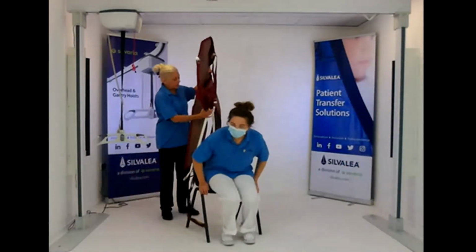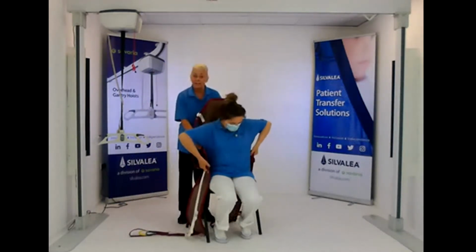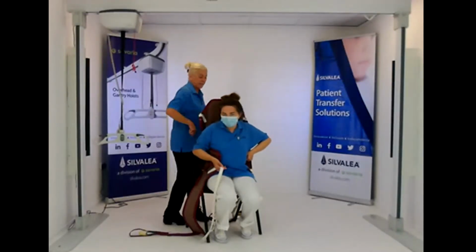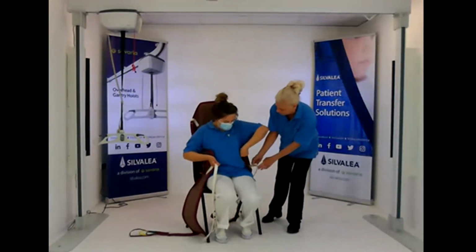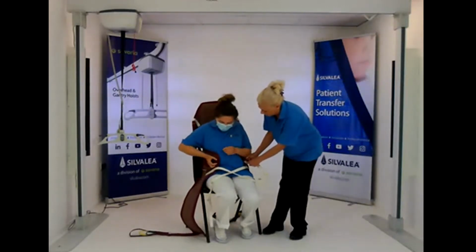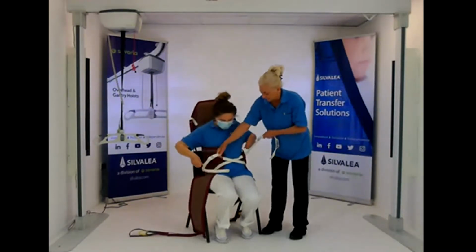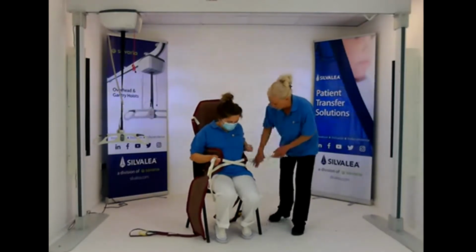But going back to this style, I'm going to put it on Laura in the chair. Now, because we're not going too far down, it's just fitting to the waist level. It's easier to put into a tighter chair, so you've not got to struggle down because it's firm and you're just getting to the belt line here. So it fits around the trunk, and then we've got these straps that cross over and feed through on the opposite side. So we're getting a position like that. So it's going to hug the trunk and torso there.